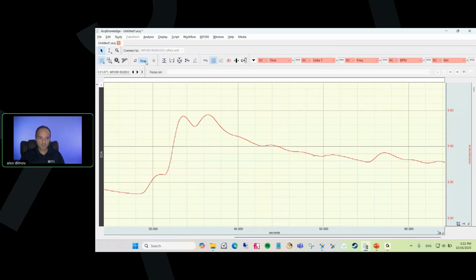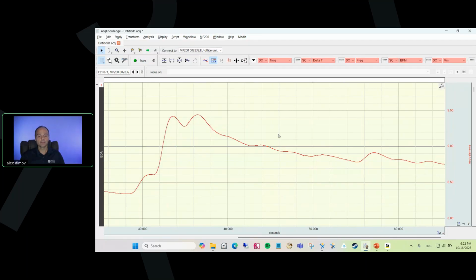Now, what happens if you don't get any of that? You ask the person to take a deep breath, but there's no response. There's a couple of options here. They could be a non-responder, meaning that no matter what you do, they'll have a signal that remains very, very low and flat. That's about 10% of the population, so it's considerable.